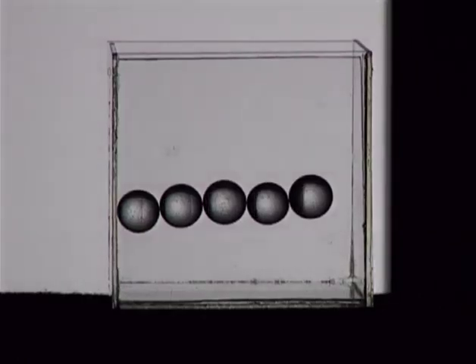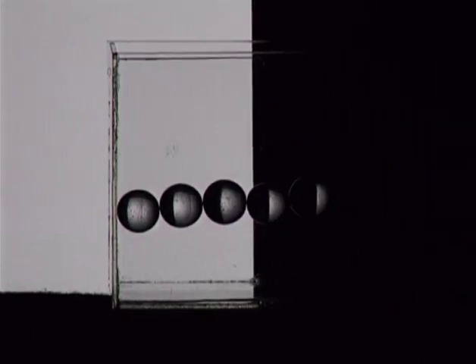Here, the part of the spherical object seen against the dark background appears bright, and due to the imaging properties of the refracting objects, the part seen against the bright background is dark. Such a contrasting background visualizes corneal microcysts at a high contrast. What is the purpose of observing refracting phenomena?